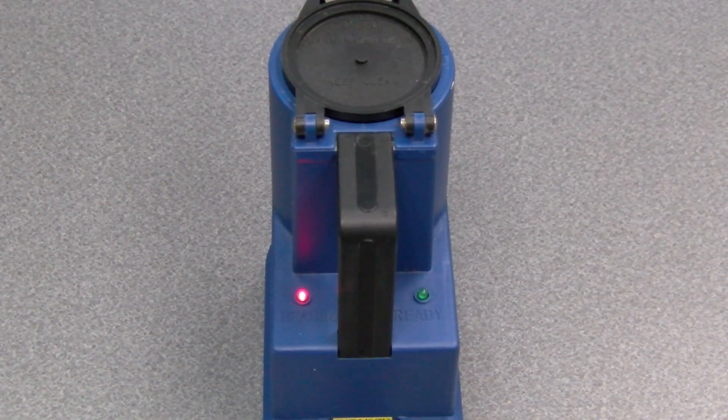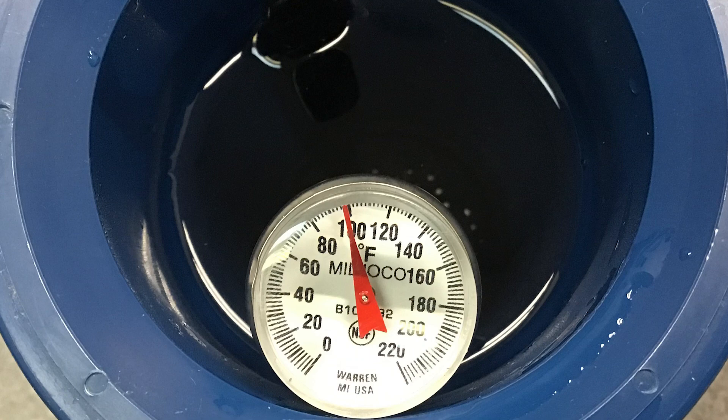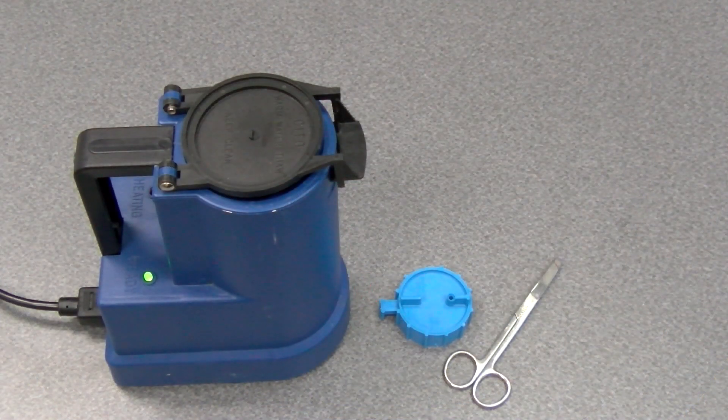If using an electronic water bath, make sure the unit is turned on and has reached the correct temperature before using. Use a thermometer to confirm the temperature of the water before inserting a straw of semen. Occasionally these units may need calibration to keep the water at the recommended temperature.